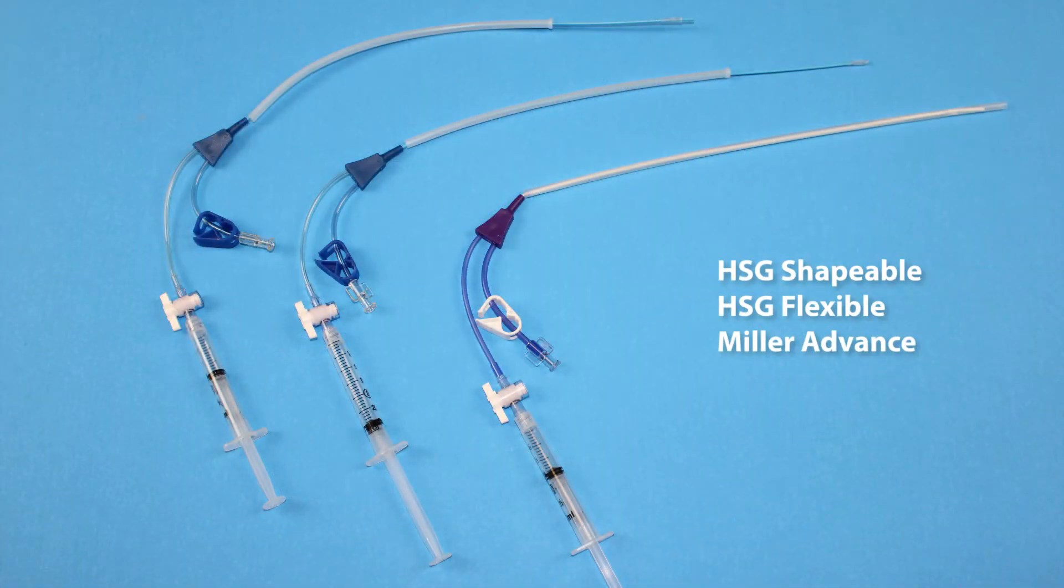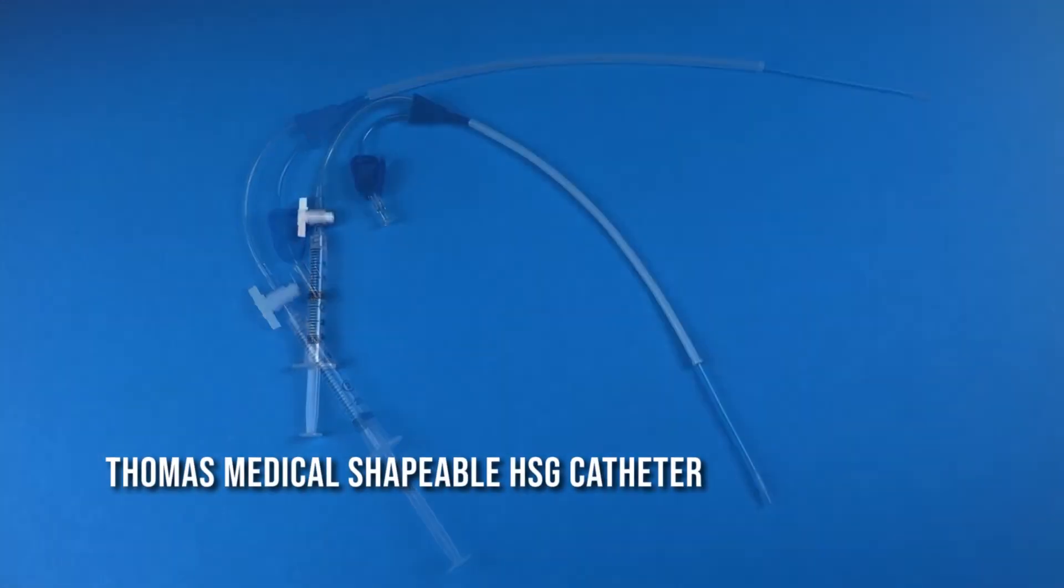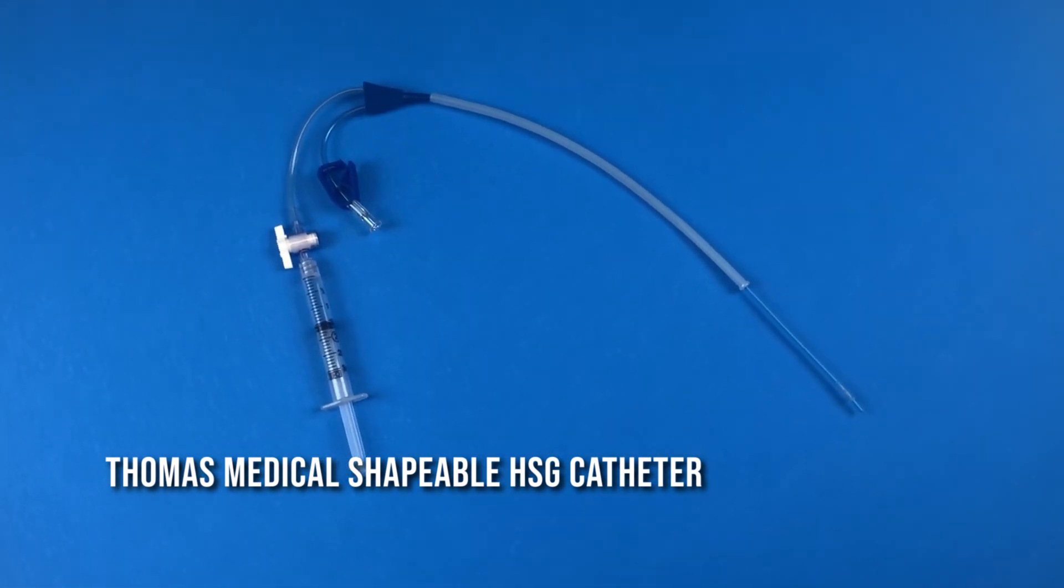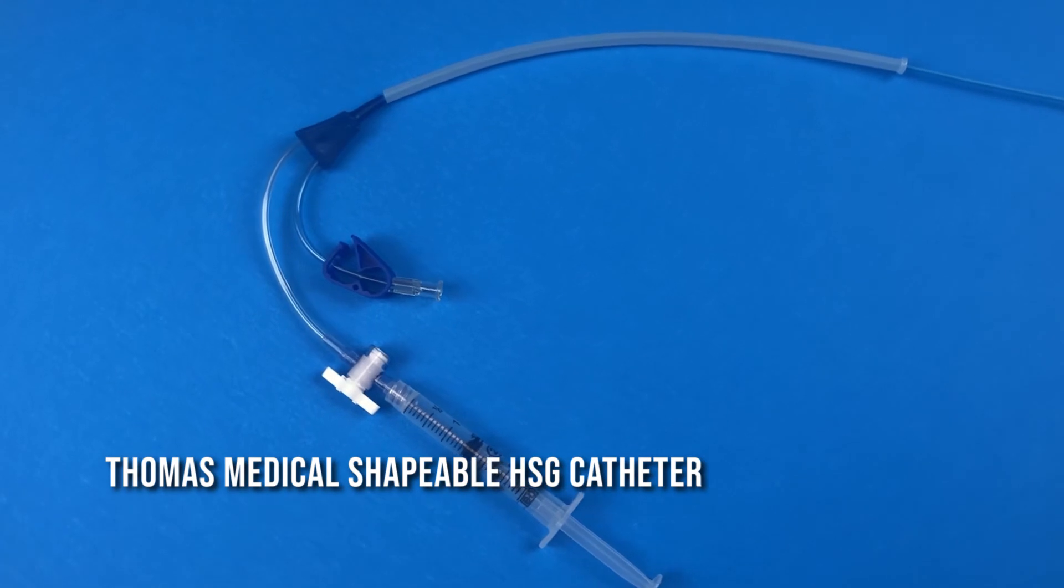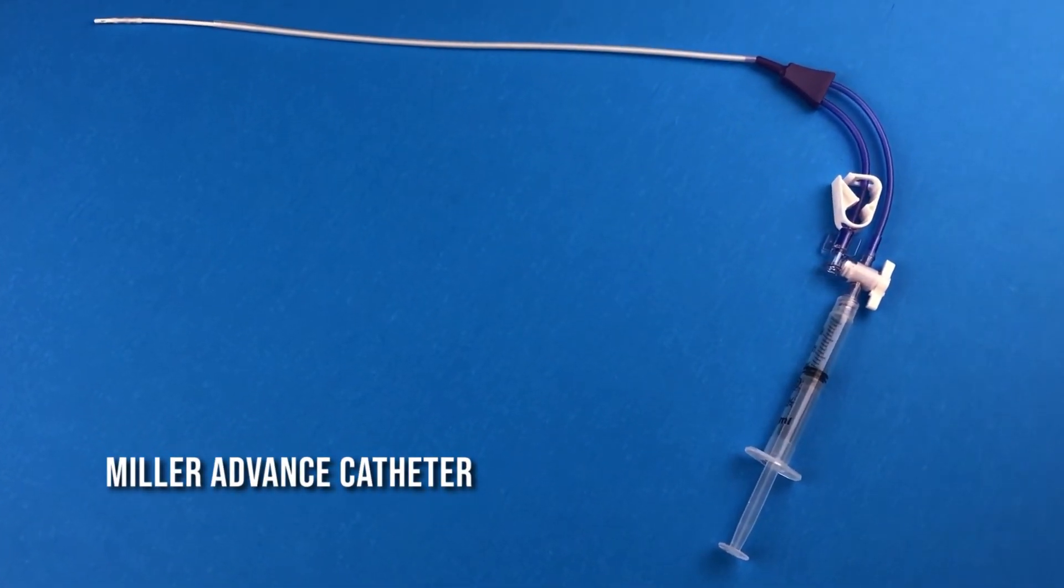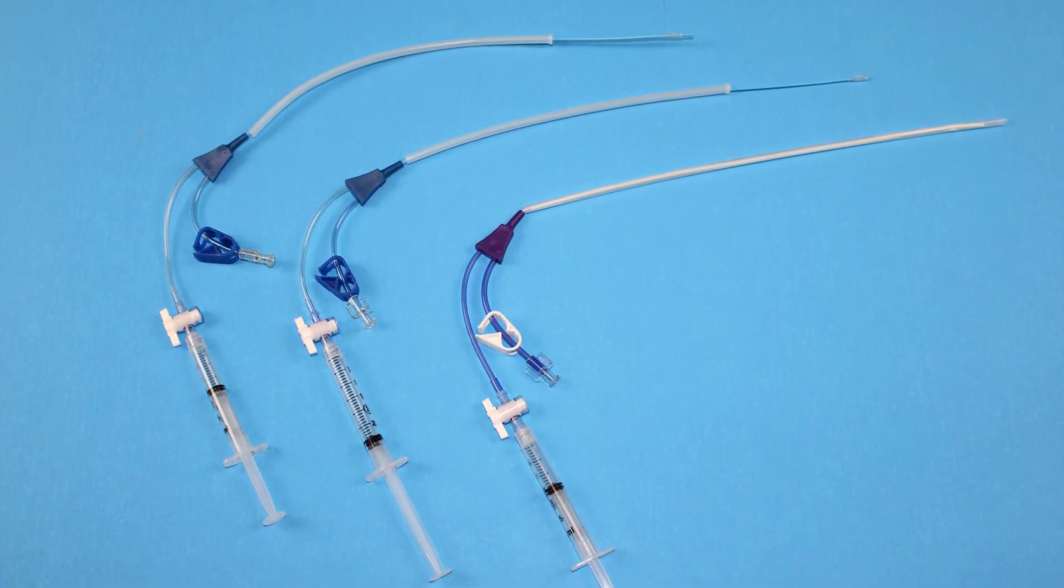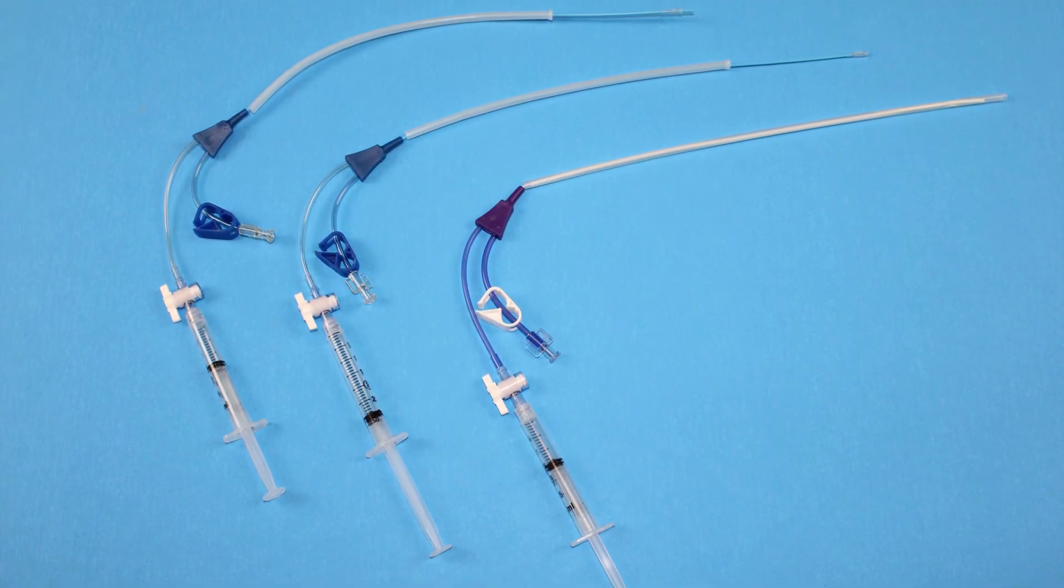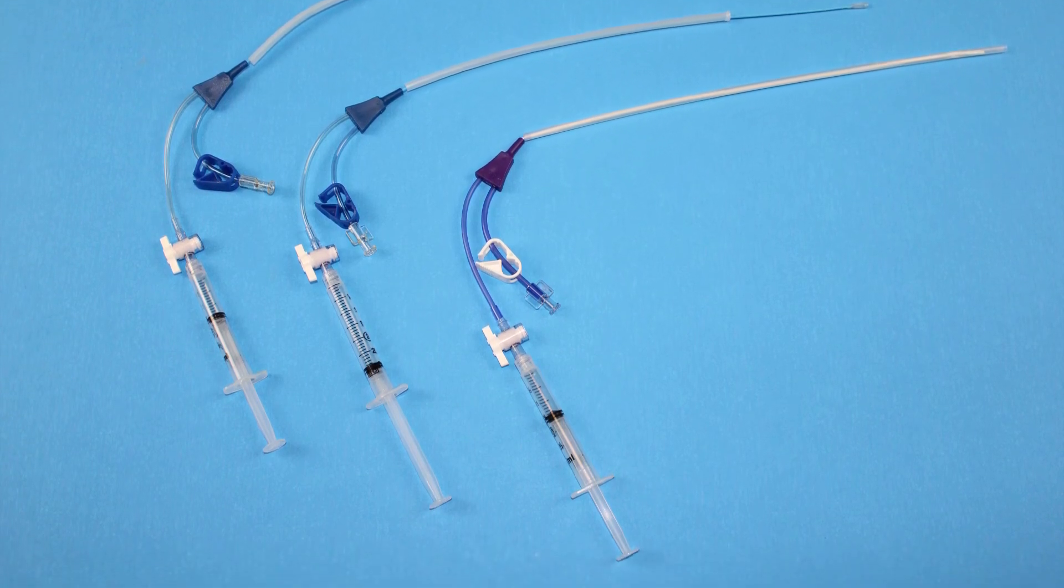Thomas Medical offers three kinds of HSG catheters: the flexible, which was demonstrated; the shapeable, which further accommodates anti- and retroflex uteri with the use of a stylet; and the Miller Advance, which provides a gentler experience for many patients. All of Thomas's catheters are available in 5 French, with the flexible and shapeable styles also available in 7 French.